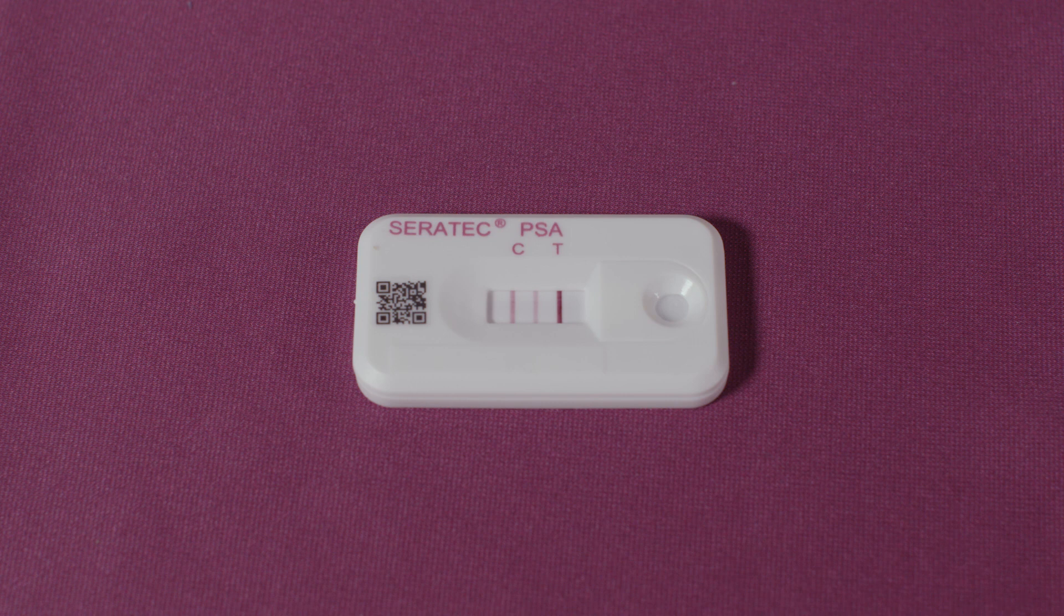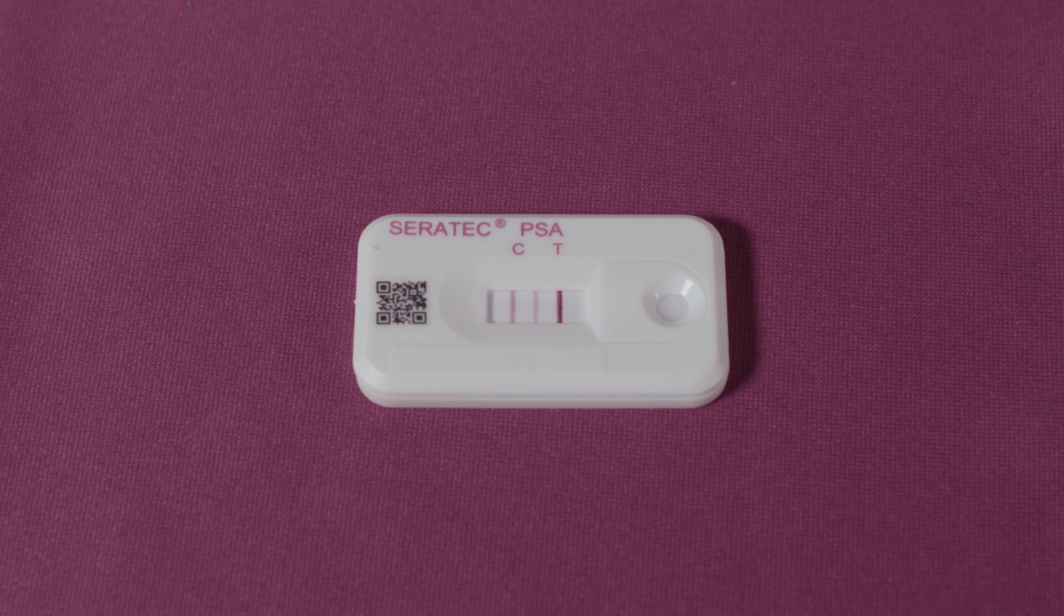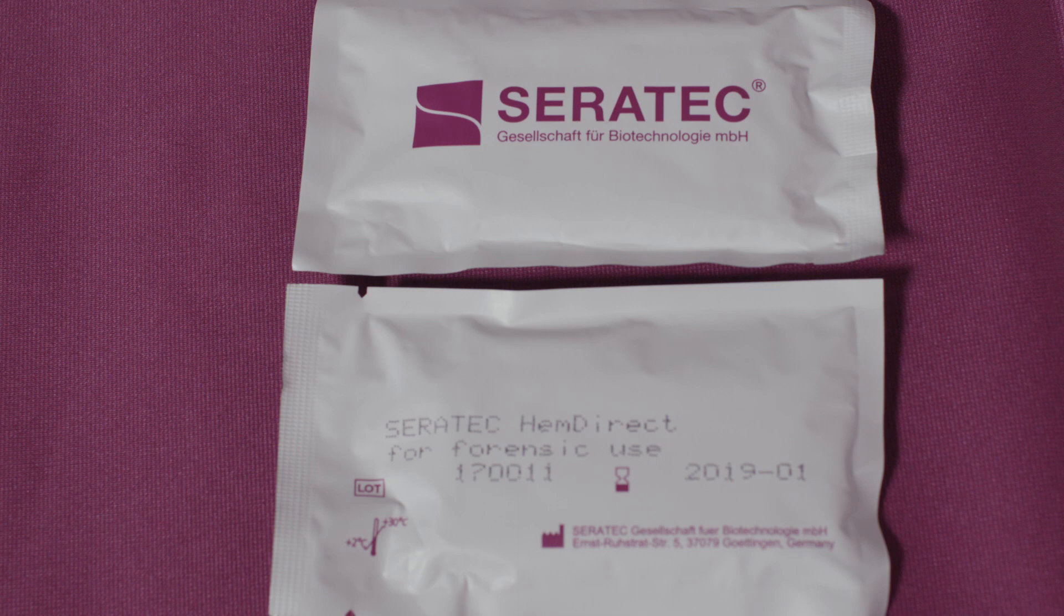The Ceratec PSA semi-quant test utilizes two different human specific monoclonal antibodies for the detection of human PSA. The test cassettes are supplied in individually wrapped packages with lot number and expiration date information written on the outside of the package.